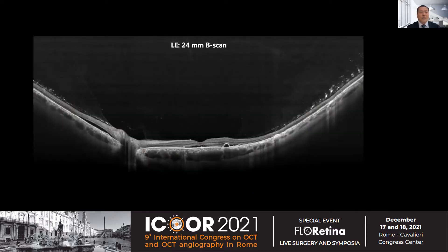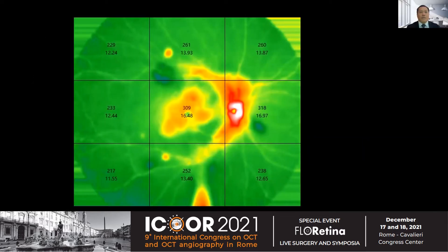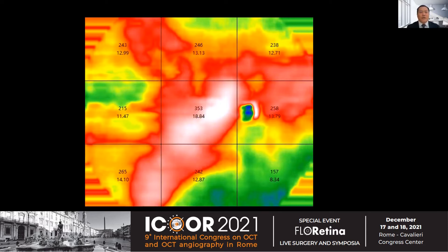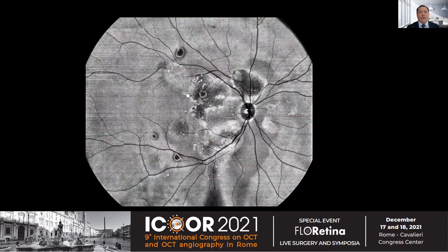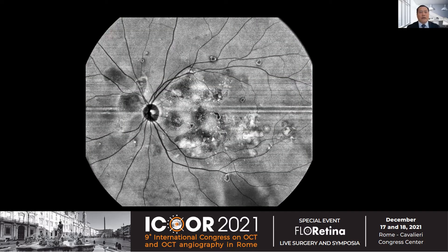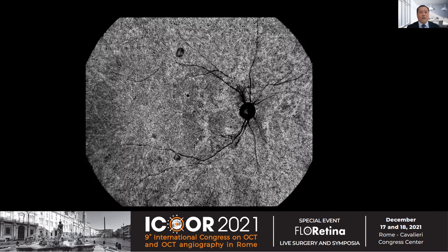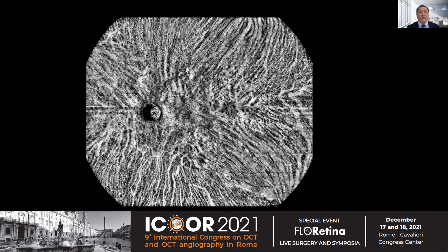This is a CSC patient. The 24-millimeter B-scan shows subretinal fluid and PED with patchy choroid on the left eye and right eye. This is 24-millimeter retinal thickness quantification on the right eye and left eye. This is 24-millimeter choroid thickness quantification on the right eye and left eye. We can visualize 24-millimeter outer retinal OCT and 24-millimeter wide-field choriocapillaris flow of the right eye and left eye.